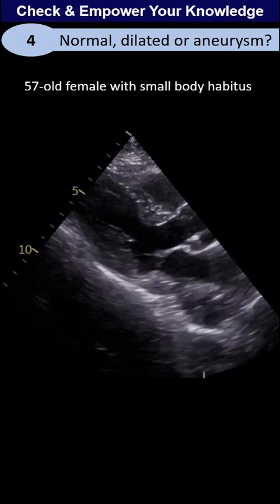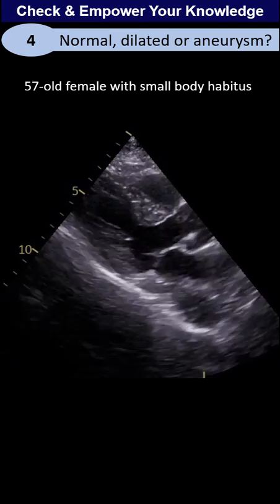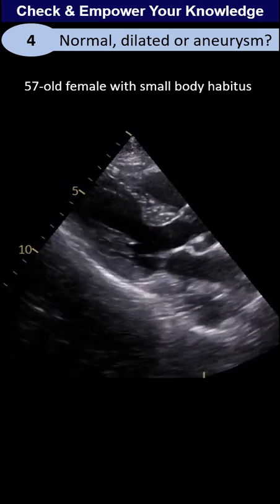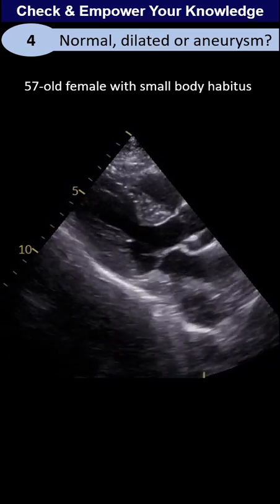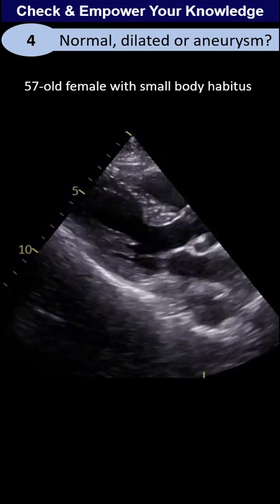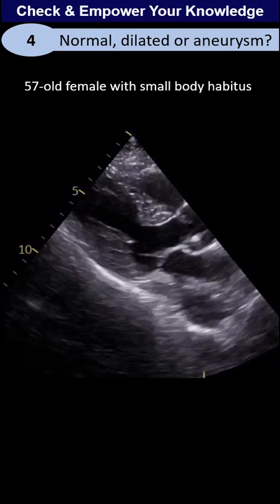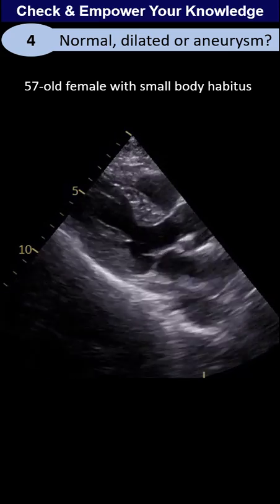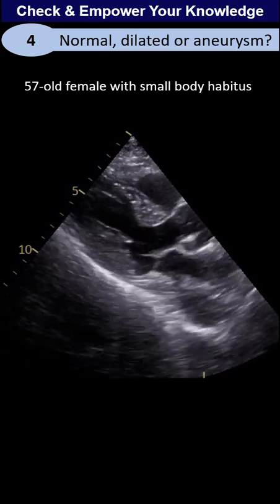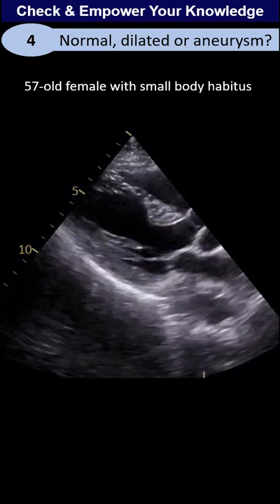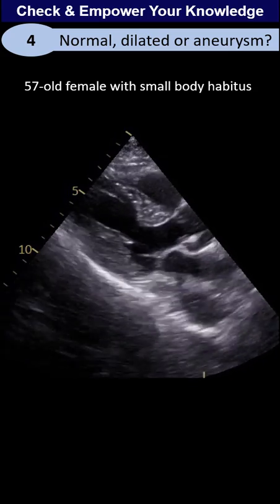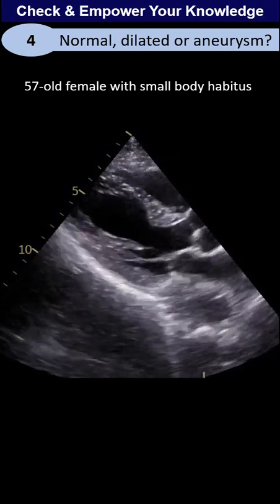Hi everyone. In this clip I'm going to give some tips on measurement. We have a patient, a 57-year-old lady — a small lady — after a heart attack. They ordered an echo, and on this image, as you can see, we have plaques.